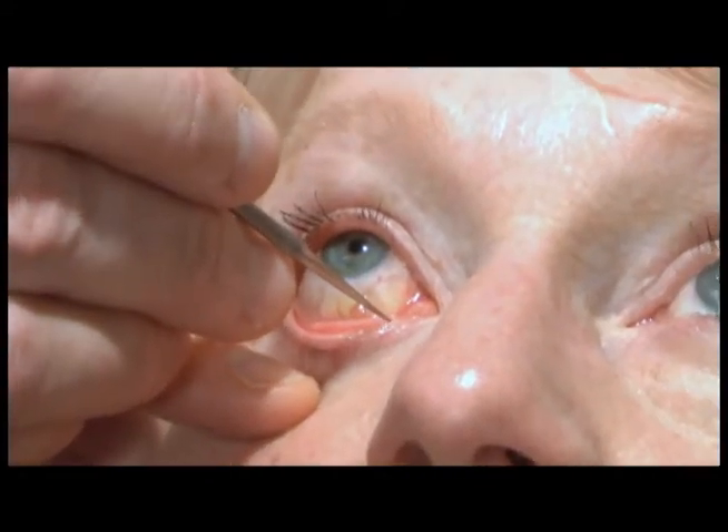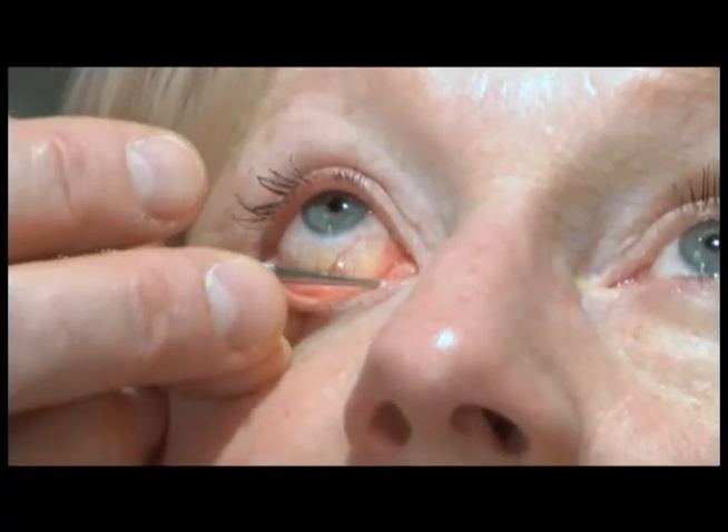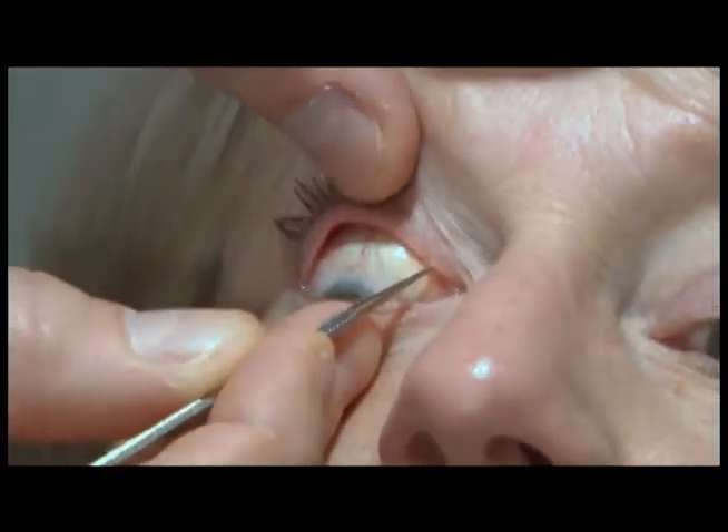Evaluation of the lacrimal system involves dilating the puncta first. The lower puncta is dilated with the punctal dilator, placing the dilator vertical followed by horizontal. The same is then done for the upper punctum, again passing the dilator vertical followed by horizontal.